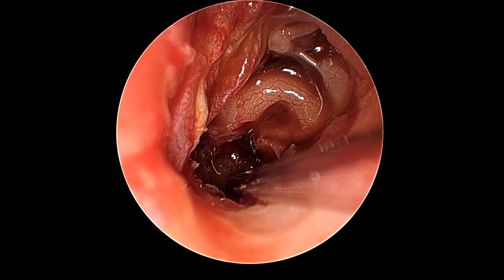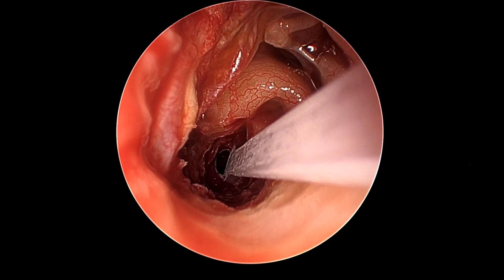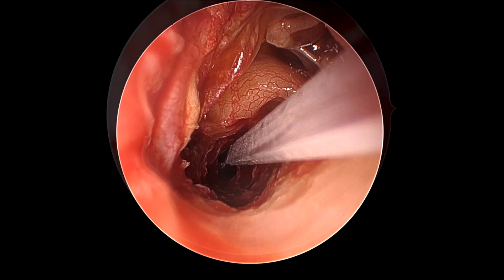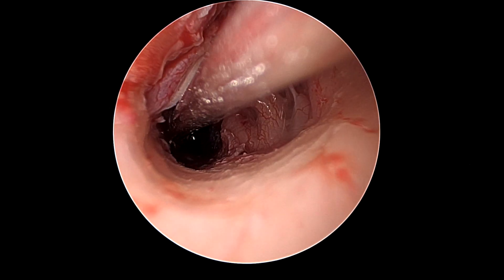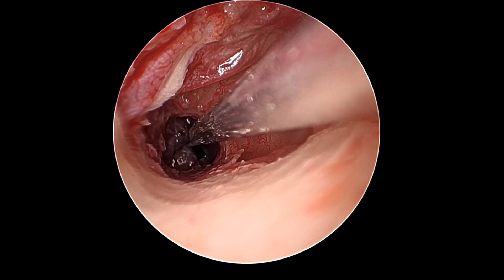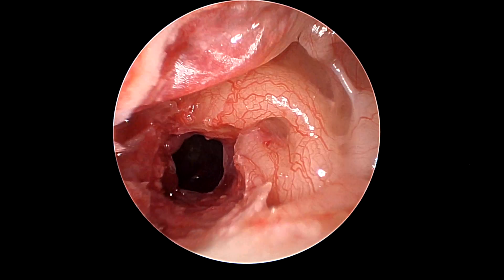The opening is then suctioned and then widened with a tympanoplasty blade and underwater drilling with a 2 mm diamond burr to gain at least a 5 to 6 millimeter opening which will hopefully stay open long term. The region is then washed with 500 mils of body temperature saline to clear as much of the cholesterol granuloma out.